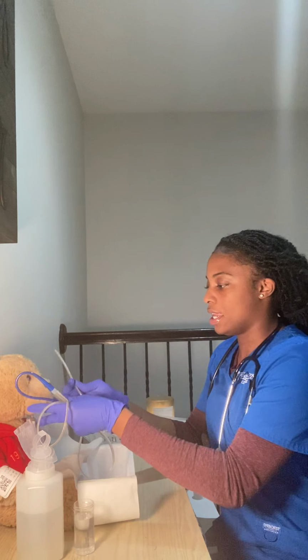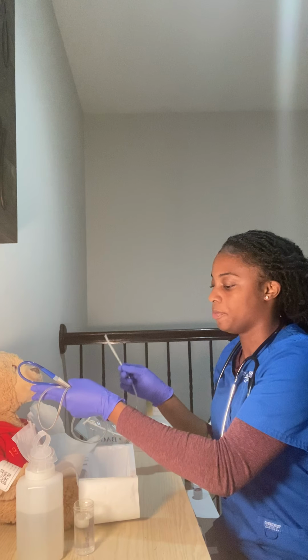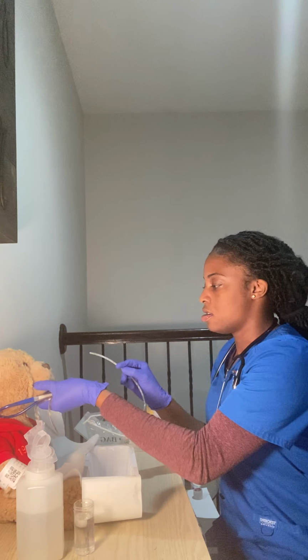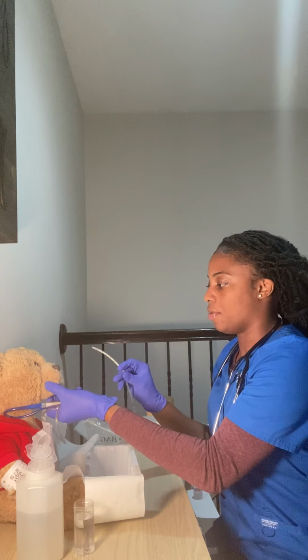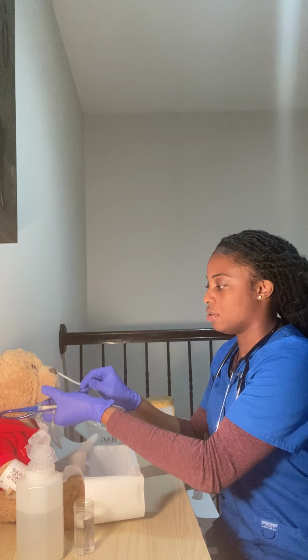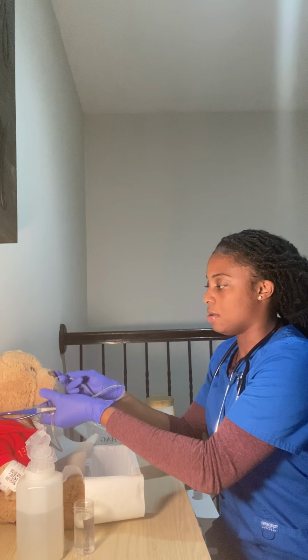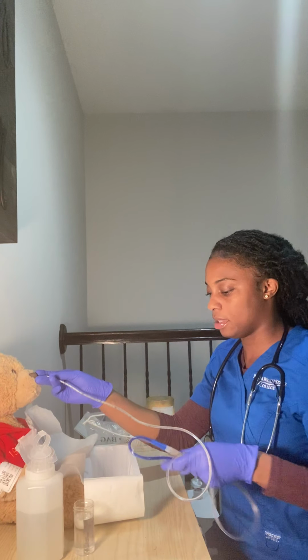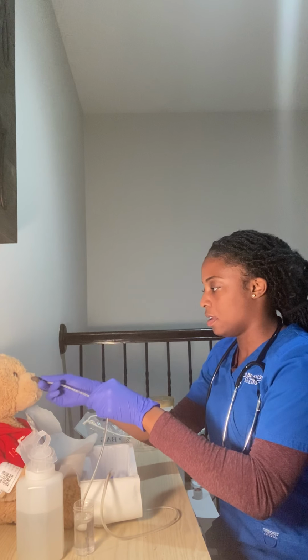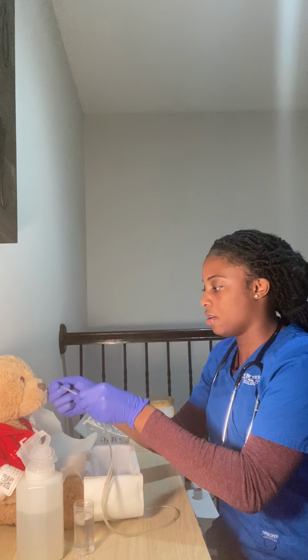So we're gonna go ahead and I'm gonna compare the nares. We're gonna go ahead and put it into the right because the right naris is a little bit bigger. And we're going to tilt his chin up, lean forward, and we're going to go ahead and insert. So I'm gonna go ahead and insert into the right naris. And I'm gonna keep going. If I feel some resistance, I would stop a little bit. And this I'm gonna have in my basin. I'm going to keep going until I hit the 30 mark.